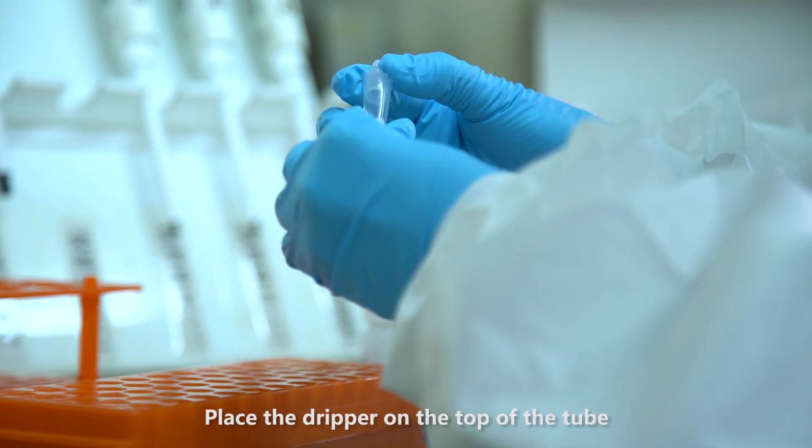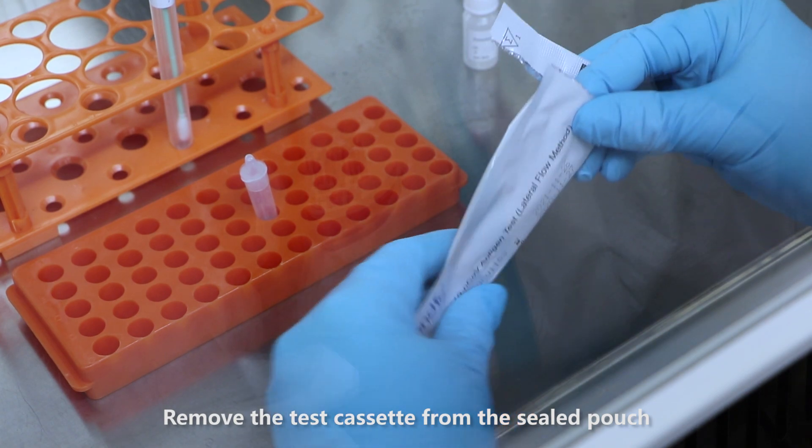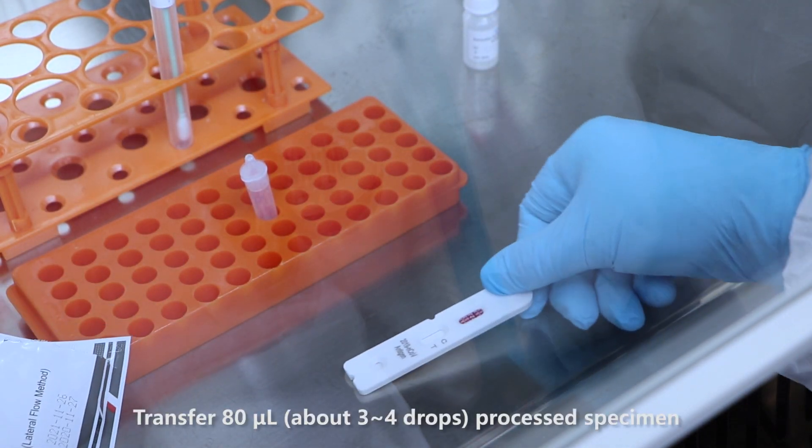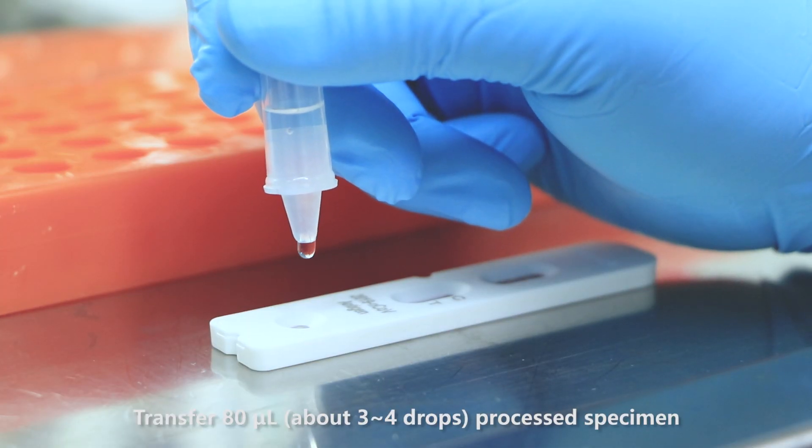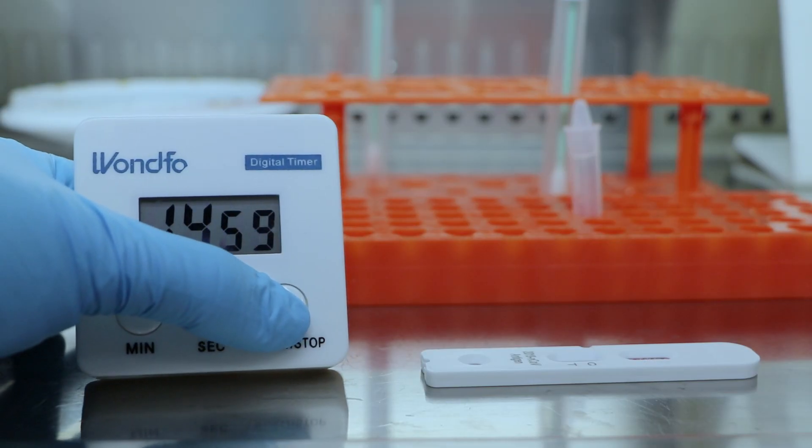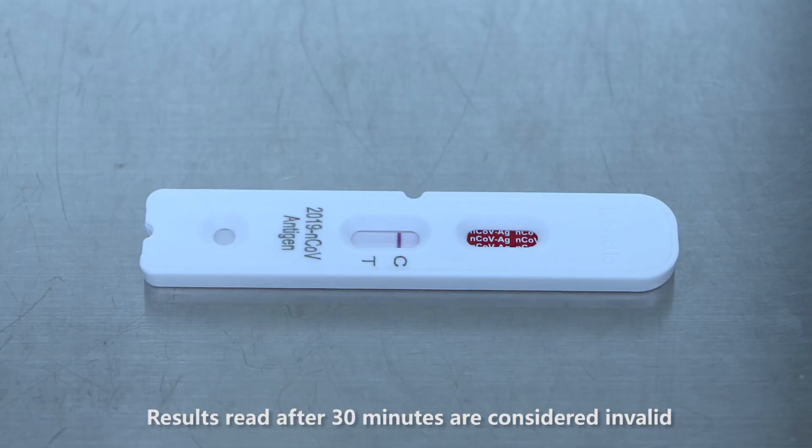Place the dripper on the top of the tube. Remove the test cassette from the sealed pouch and place it on a level surface. Transfer 80 microliters, about 3 to 4 drops, of processed specimen to the sample well and start the timer. Read the result at 15 to 20 minutes. Results read after 30 minutes are considered invalid.